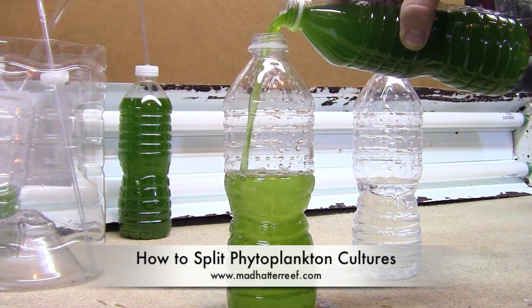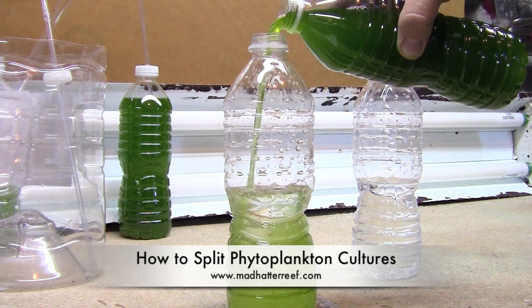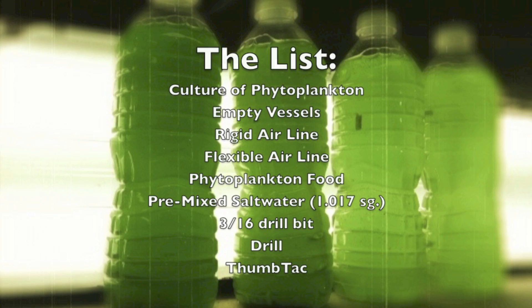Hey guys, it's Jeff for MadHatterReef.com and today we're going to be talking about how to split your phytoplankton cultures. Here's a quick list of things that you will need.